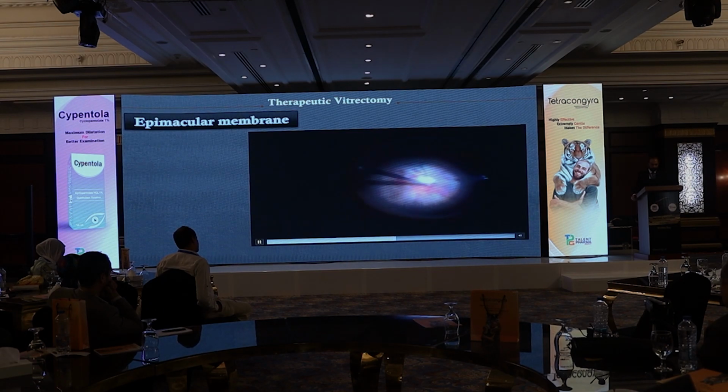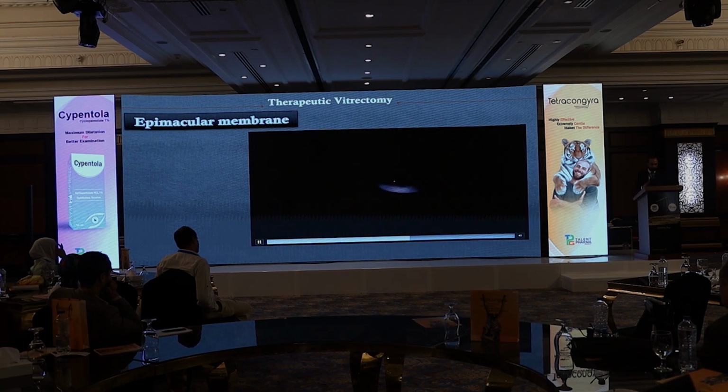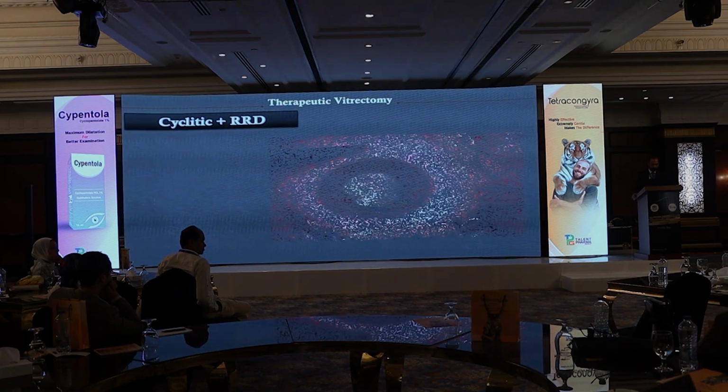Again, the patient had a chronic inflammation, an epimacular membrane on the macula, and there's some peripheral membrane with minute holes, maybe due to manipulation in the first surgery. We didn't know the cause of it, but Kenacort aided after vitrectomy.